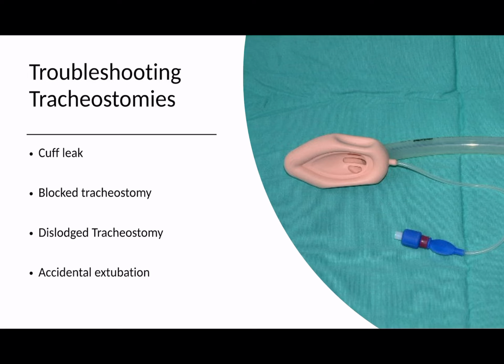We sometimes do it in patients in theatre, and it works really nicely. So if you're finding it difficult to get oxygen in, or you can't get oxygen in through the mouth, you could try using an LMA, occluding over the tracheostomy stoma site, and ventilate through that.